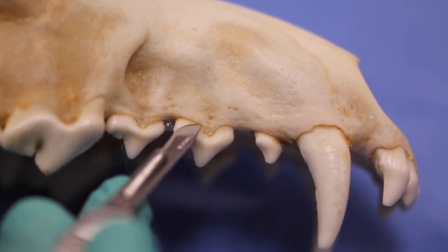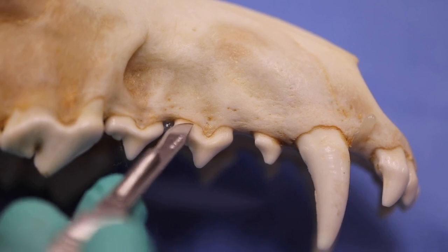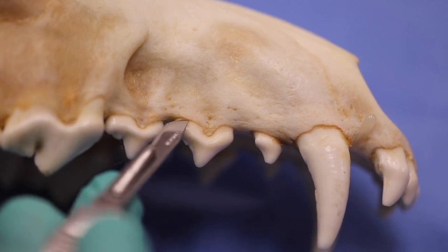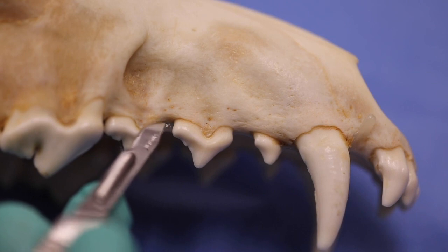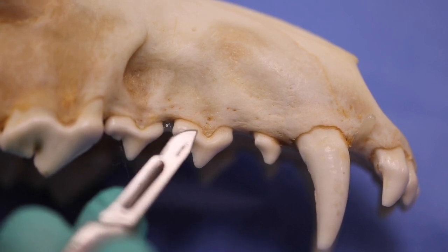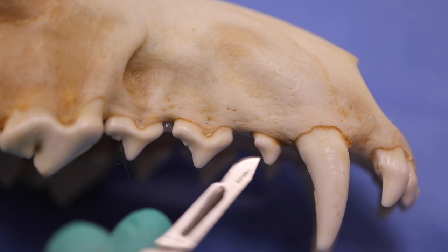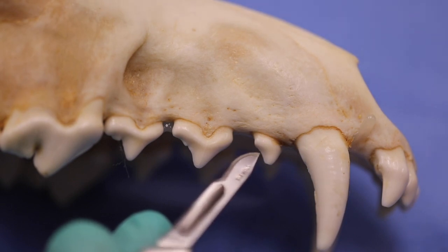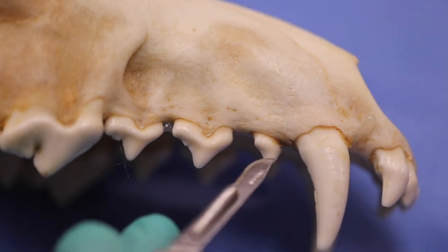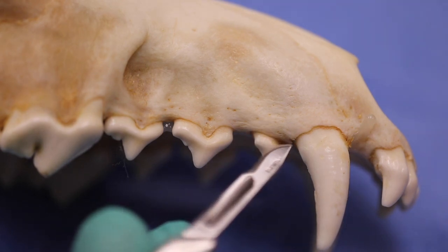This allows for a very safe approach, keeping in mind that that angulation needs to be present throughout the length of the incision. You can ensure that your flap initiation will allow for non-traumatic exposure to that bone and make your whole procedure a lot quicker and easier.